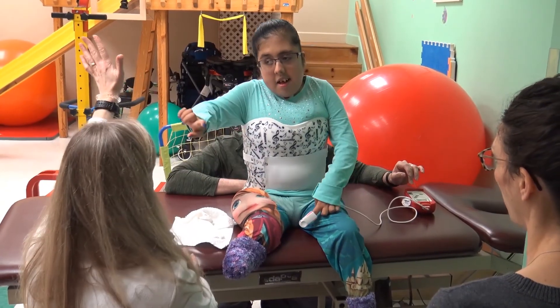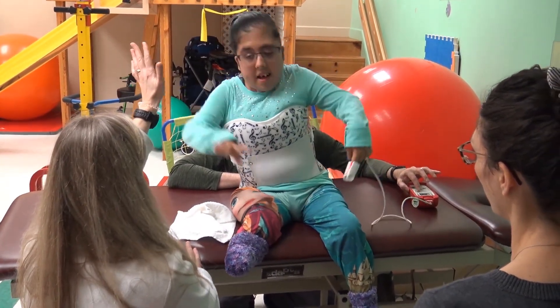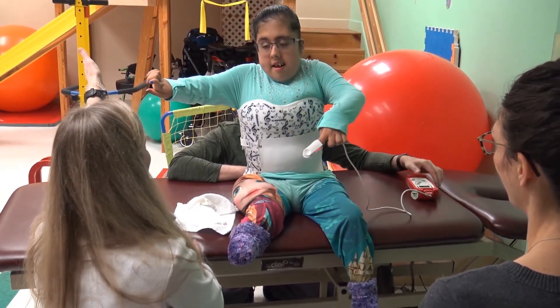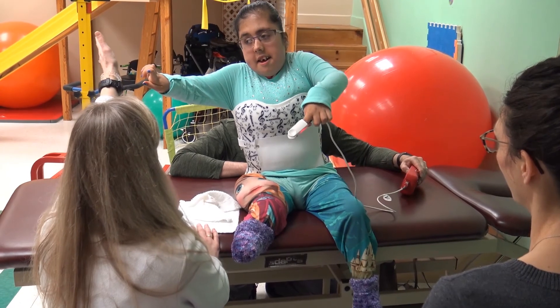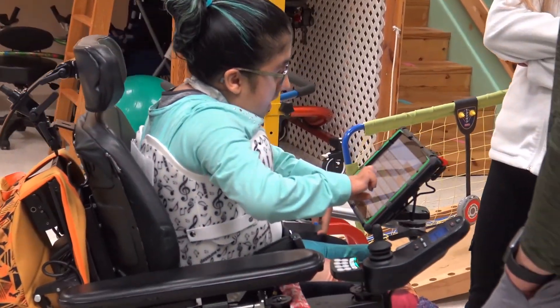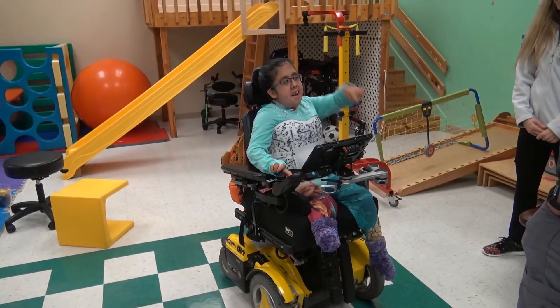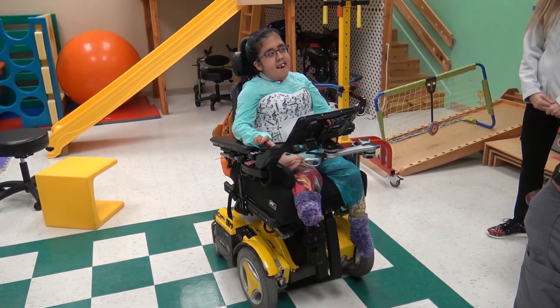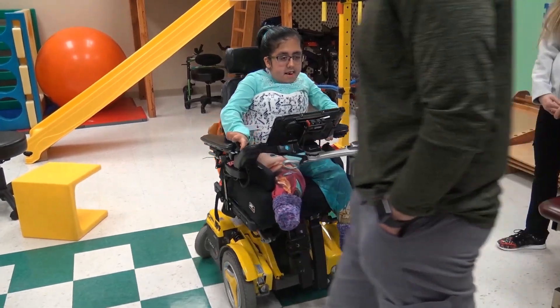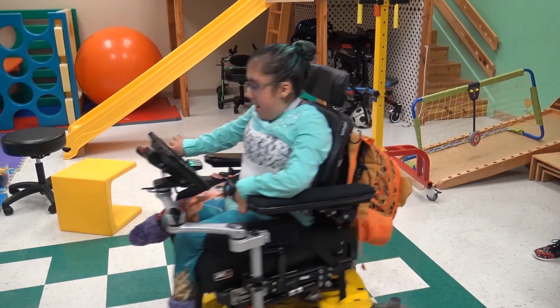When you choose the SureStep TLSO, you are helping your patients gain strength, postural control, confidence, and the ability to participate in their lives. Your referral sources and parents will be so happy to have a solution that helps their kiddos maximize their potential. For more information on ordering, fitting, and additional modifications, come visit us in our booth.